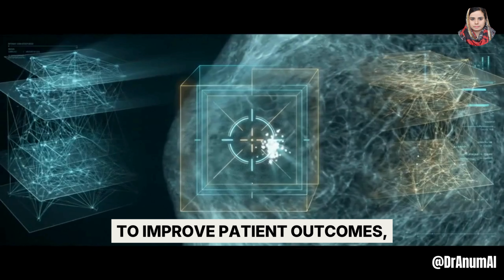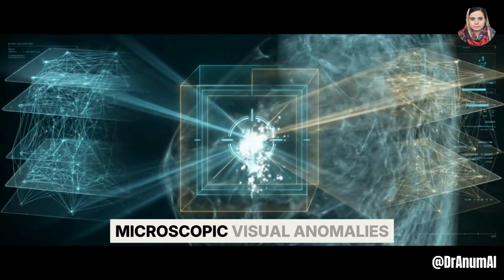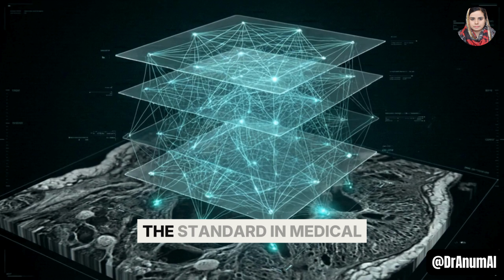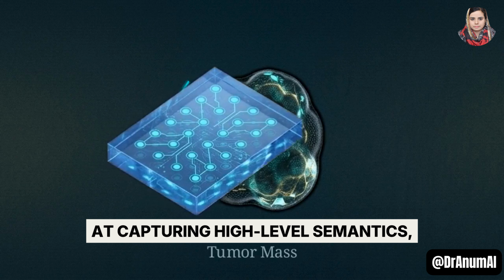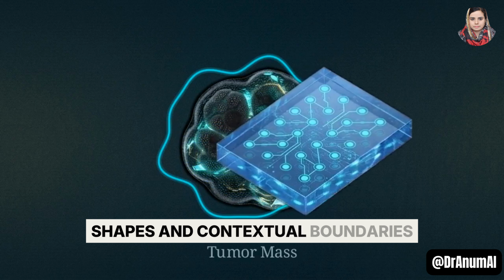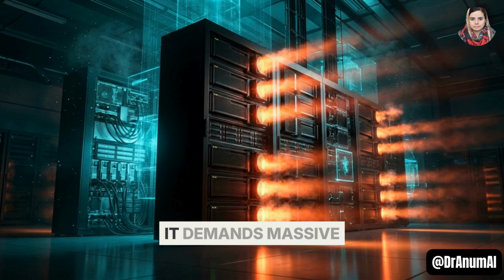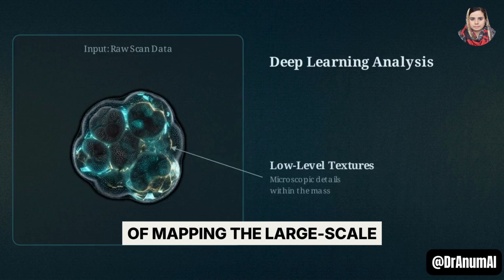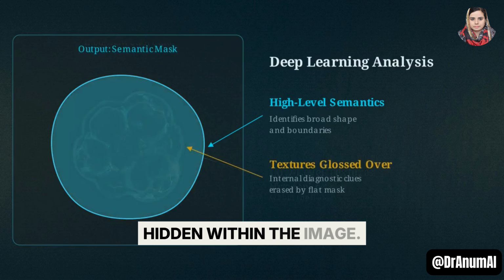To improve patient outcomes, we have to find a reliable, automated way to consistently locate high-intensity microscopic visual anomalies before those cells have a chance to metastasize. Currently, the standard in medical artificial intelligence relies heavily on deep learning. These modern models excel at capturing high-level semantics, recognizing the broad overall shapes and contextual boundaries of a mass. But deep learning has a significant vulnerability. It demands massive computational resources, and in the process of mapping the large-scale context, it frequently glosses over the fine microscopic textures hidden within the image.